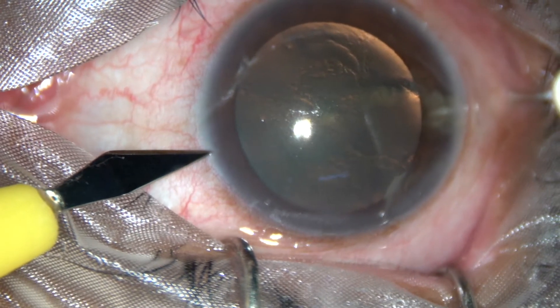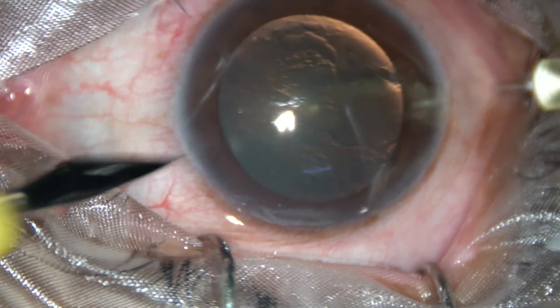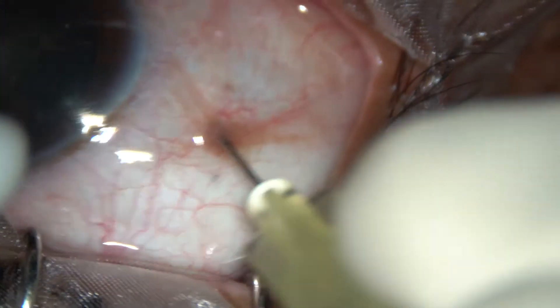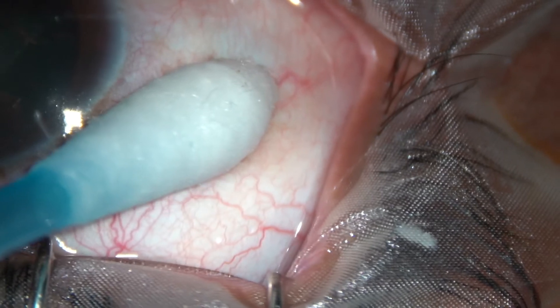I take a lancet knife, make a small puncture and drain out some aqueous humor. Then I take a cotton-tipped bud, remove the needle, and tamponade the injection point with the cotton-tipped bud.